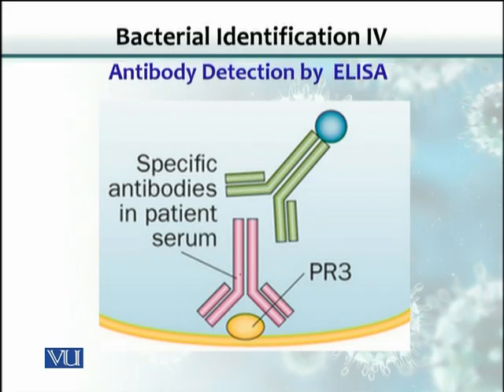But because this antibody has come from the serum, we don't know whether the serum had this antibody or not. In order to know whether this antibody is there, we would have to use another antibody which we have labeled with some radioisotope, enzyme, or fluorescent dye. As I mentioned earlier, this antibody, because it is a protein in nature, is a very good antigen as well.